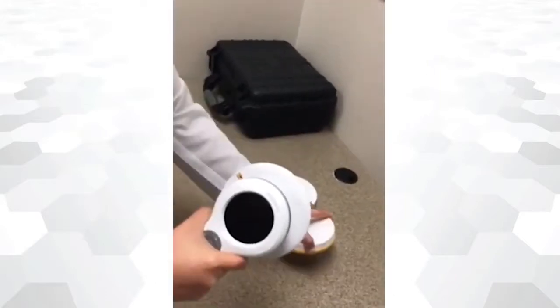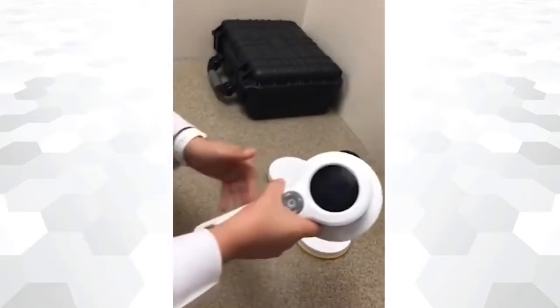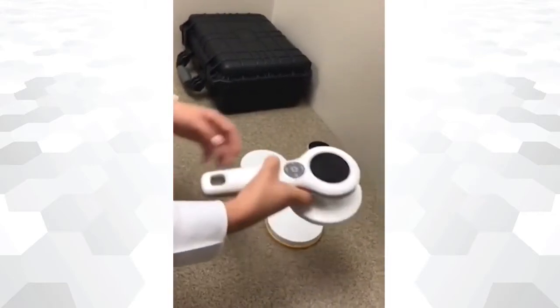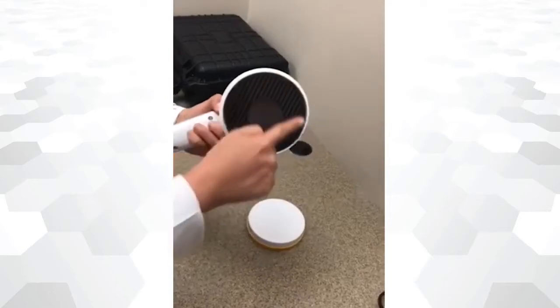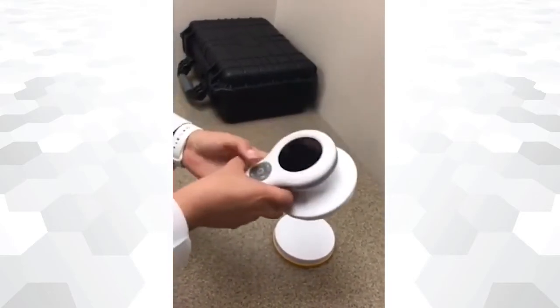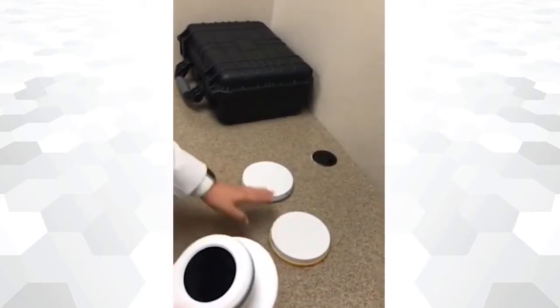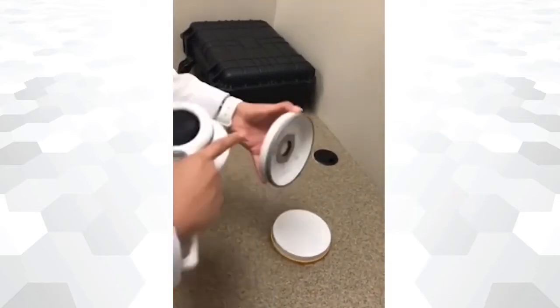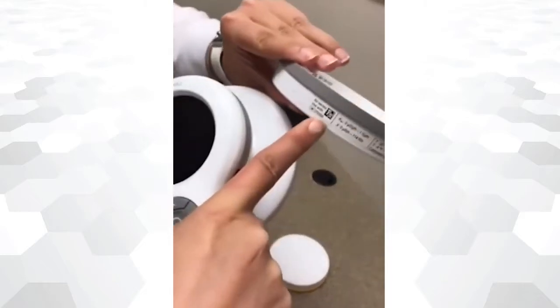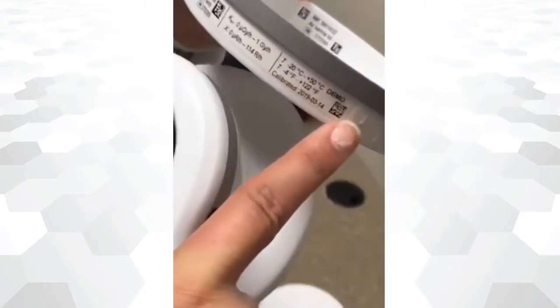Let's have a quick look at RACE-A 452 and its features. The instrument is easy to handle and requires minimal effort to carry around. It contains silicon diodes and a metal grid for Geiger-Mueller mode. There are two lids. The gray lid identifies the mode for air kerma, and its label contains additional information regarding the ranges to perform air kerma measurements.